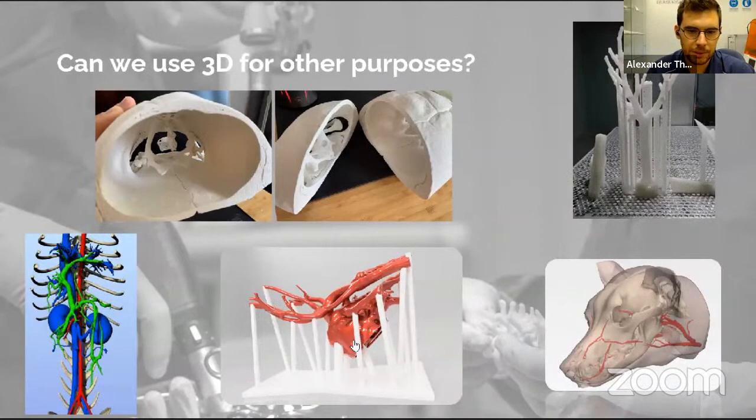The bottom middle image shows a dog with a double aortic arch. Both the right aorta and the left aorta were present, where the right aorta was persistent in this dog, and we had to close it for surgical correction. But it was so much easier to see on this image what the actual anatomy looked like. So it can make it easier for a surgeon to see before going into the surgical theater.